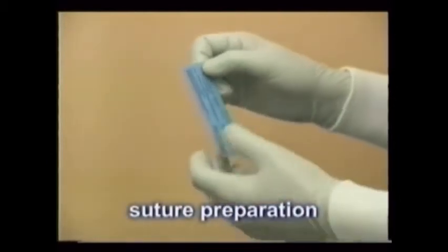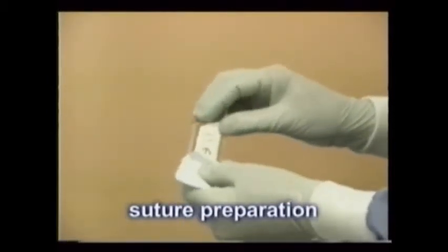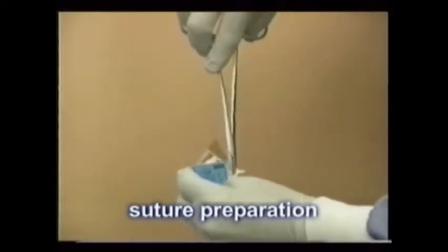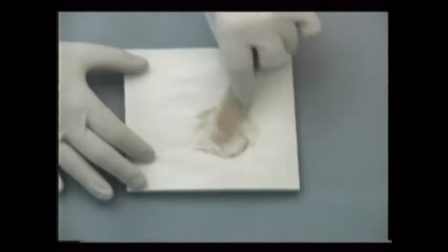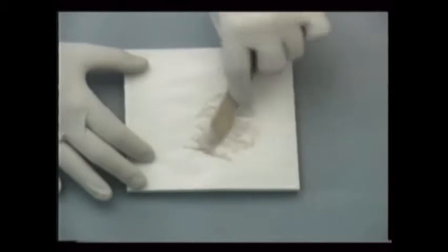After the surgical areas are rinsed clean with sterile saline and hemorrhage is under control, the gingiva are closed with sutures and possibly also using periodontal packing. The periodontal packing you mix may be prepared ahead of time, or it might be a type that's mixed just before it's needed. You may wish to wear vinyl over-gloves or place new latex gloves during the mixing. Follow the mixing instructions carefully, as they vary widely depending on the product. The goal is to get a putty similar to the consistency of soft clay.